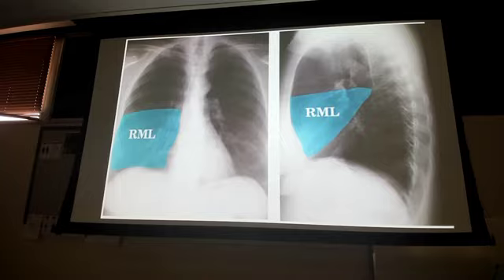Yeah. Sir? You said a lateral chest X-ray is always going to be a left lateral. Always left lateral. It shouldn't matter which side the spine is on. It's always left lateral, 100% of the time. I very rarely use that word, as I've said; I don't use always and never in medicine. But there is not any reason for you ever to see a right lateral chest x-ray.